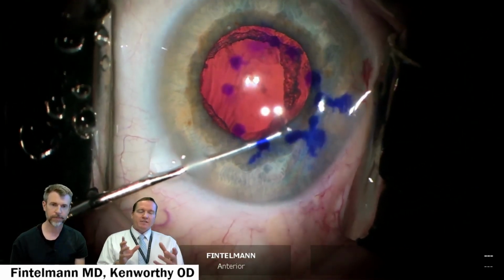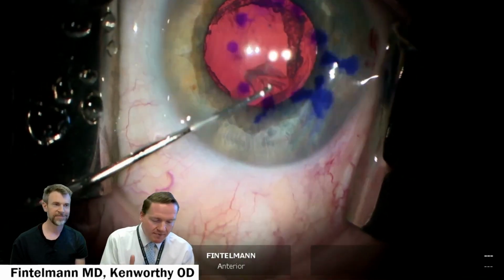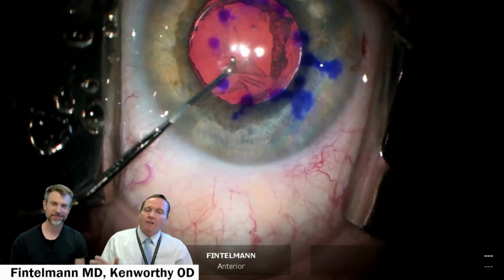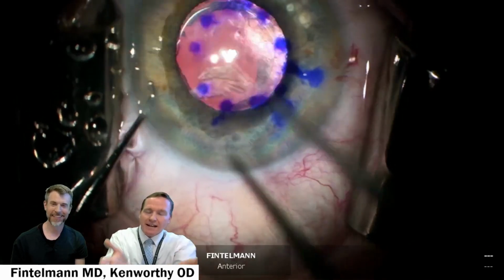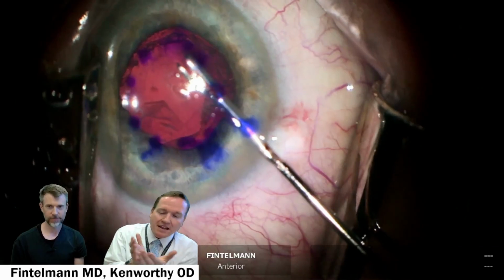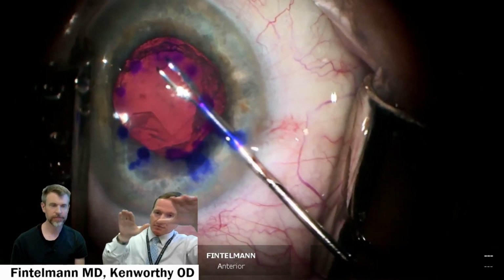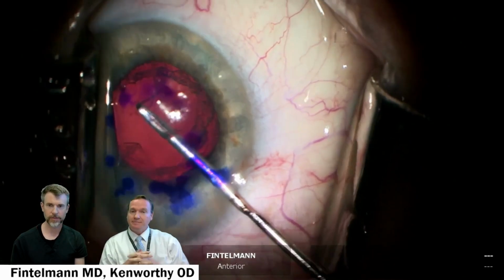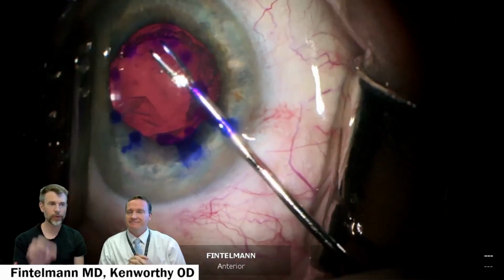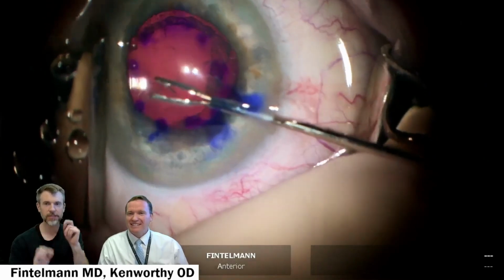Just the concept of this surgery is so intriguing to me because I think about driving a beat up car and somebody might come to me and say, look, you're better off with no car at all and riding your bike to work. And we're looking at an eye and saying, look, you're better off with no central endothelial cells. And that's really what we're saying, because remember, we're waiting for those peripheral cells to migrate in. Yes, so you're better off with no endothelium for now, being replaced by your own. We're not saying no endothelium. And again, this is the key. It's a very small area.